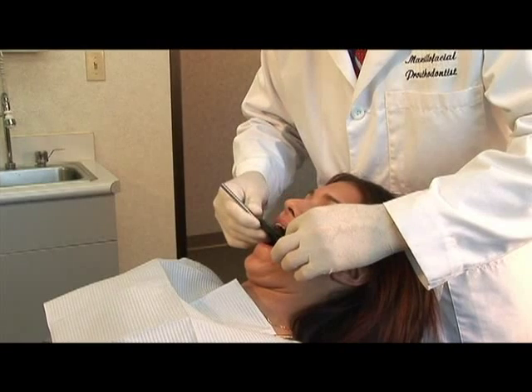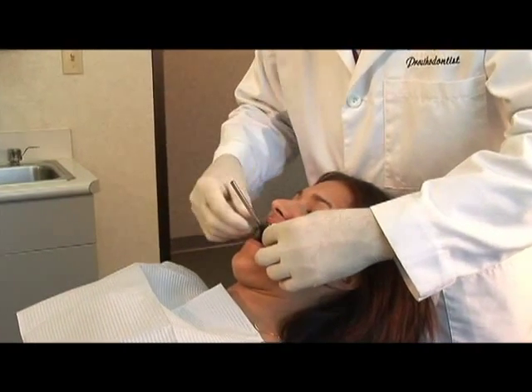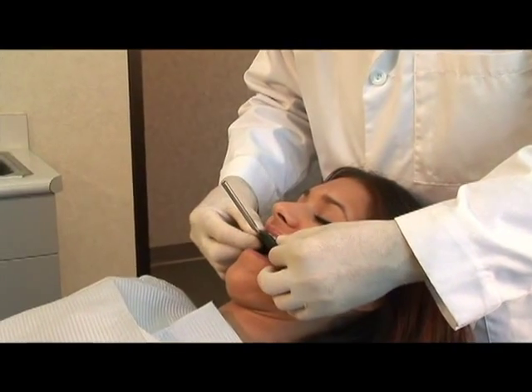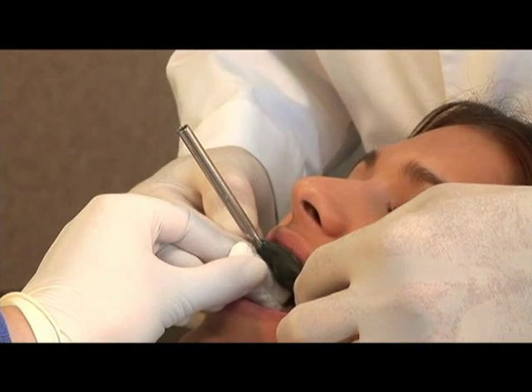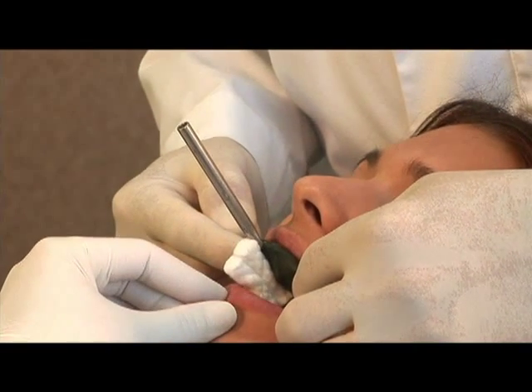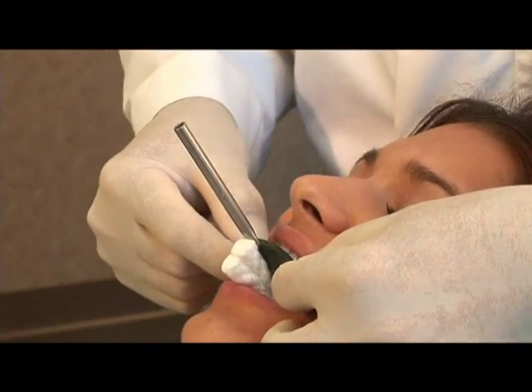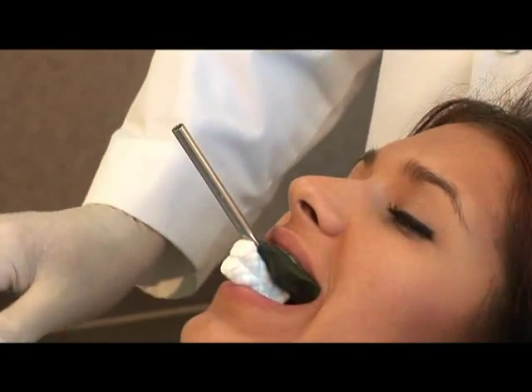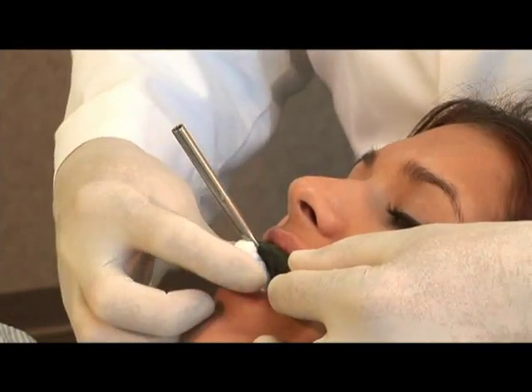Place the bite fork back into the mouth. Ensure the cusp tips seat all the way into the registration record. Support the bite fork underneath by having the patient bite on cotton rolls. Occasionally, the bite fork may need to be supported by the assistant during the recording of the facebow registration. Raise the chair up to a seated position.